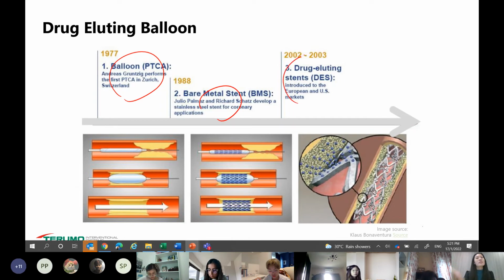So drug-eluting stents are then introduced. Drug-eluting stents mean that the drug will let the vessel know that there's no need to create new tissues here, so the vessel lumen size will be maintained. But people still try to improve. They don't want to have any kind of foreign device in your body for a long period of time.